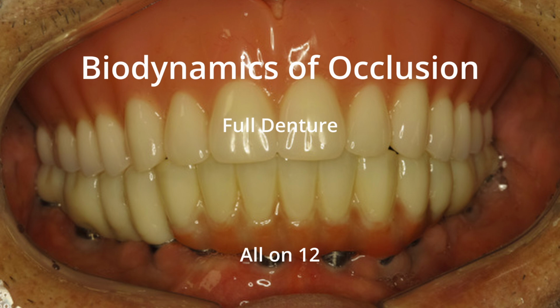If the maxilla is restored with a removable denture, mandibular AllonX, whether Allon4 or Allon6, is acceptable. It is even better if masticatory muscle atrophy reduces chewing force. However, the minimum recommended number of implants is 8. Ideally, 8, 10, or even 12 to 14 implants should be placed in the mandible. Complete implant full mouth rehabilitation in the mandible is even better.